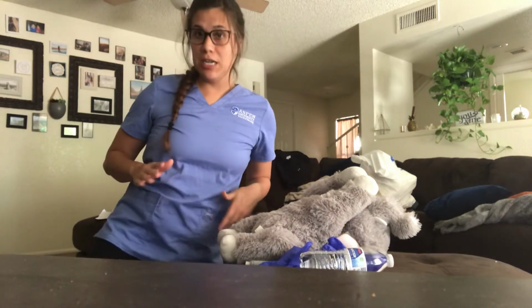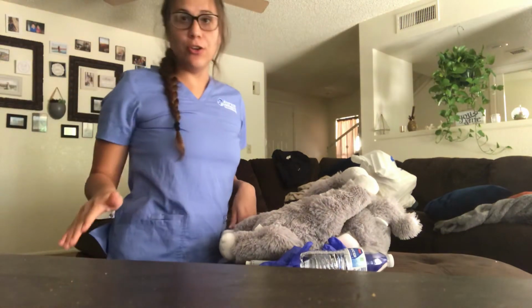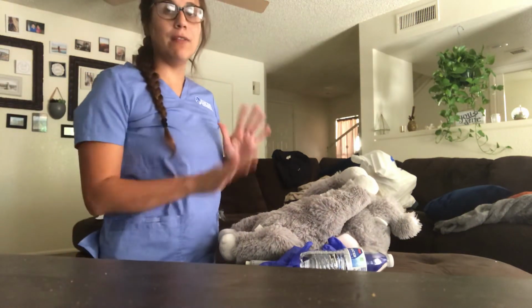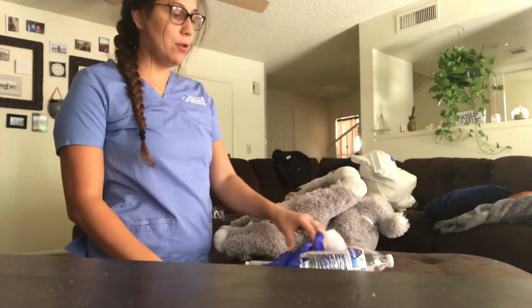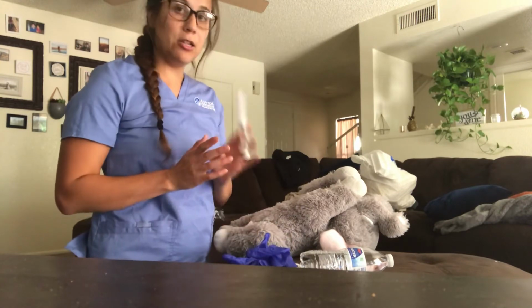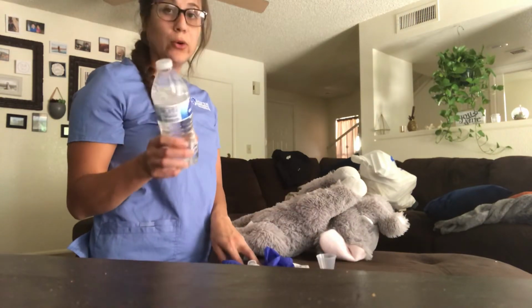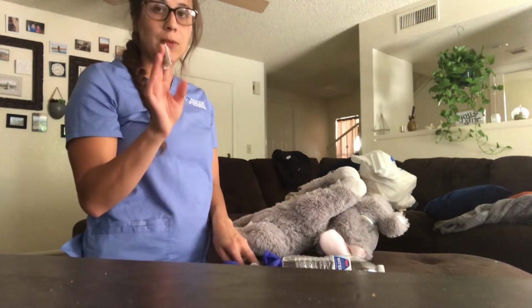This is my video for NG tube. So, of course, when you start off, you always want to check your order against the MAR, making sure that everything matches up. You want to go ahead and gather your supplies. So, for this, I have gloves, I have my syringe, I have sterile water, I have cups to put my medication in, and then also my medication.